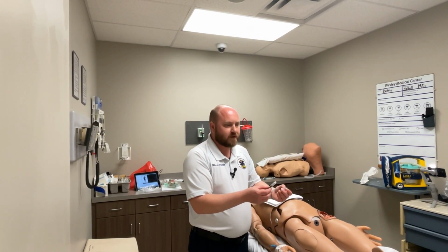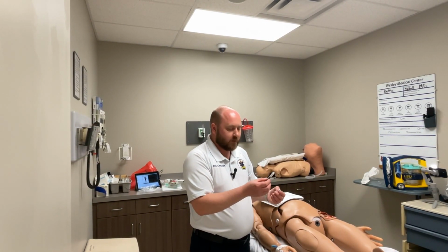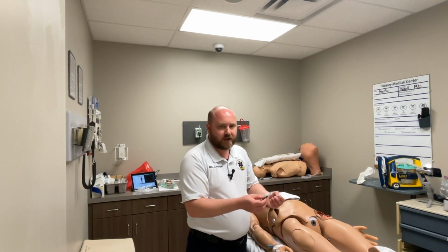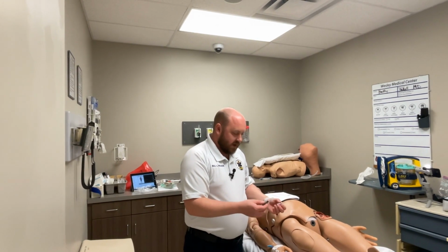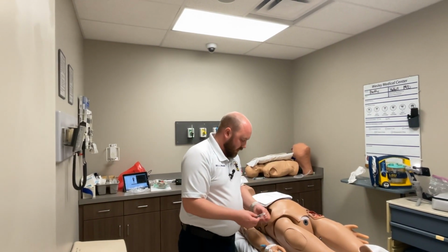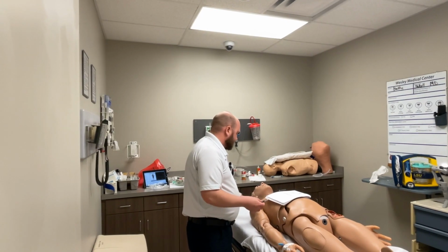What's your dose? My dose is 75 micrograms. What's your volume? My volume is 1.5. Any contraindications? No allergy. Blood pressure is good. Patient's alert and oriented. Go ahead and give it. Sounds good. Okay. Explain to our patient we're going to go ahead and give you something for pain through your IV.